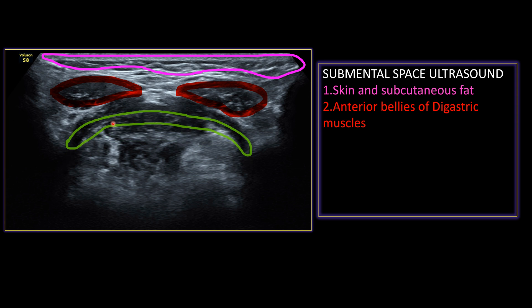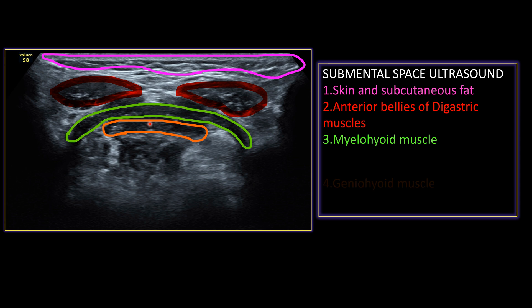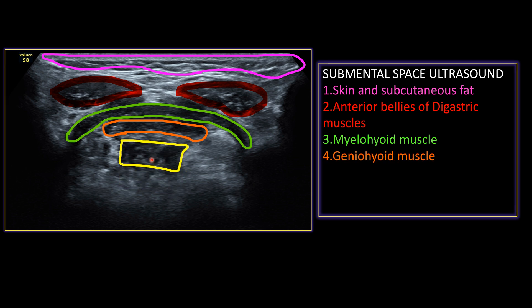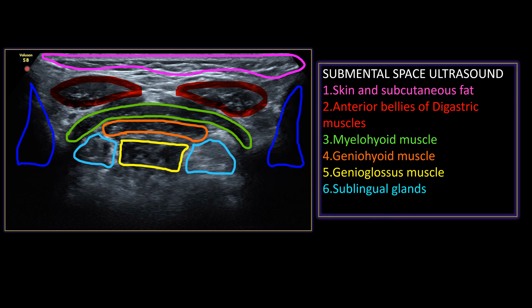Next, this is the mylohyoid muscle, next is the geniohyoid muscle, next is the genioglossus muscle. Both of these are the sublingual glands, and the lateralmost shadow is the body of the mandible. This typically mimics the frog face view.